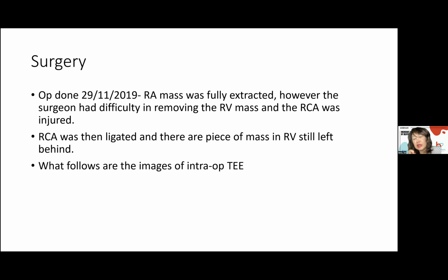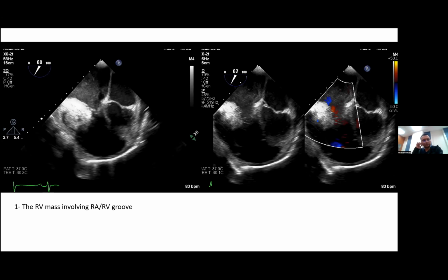They managed to take out some bulk of the mass? Yes, the RA, but the RV mass, not all. Some, but not all. So what follows are the images of the intra-op transesophageal echocardiogram.